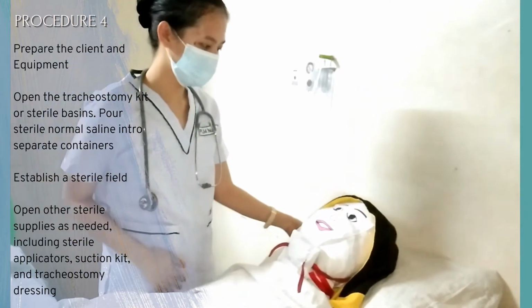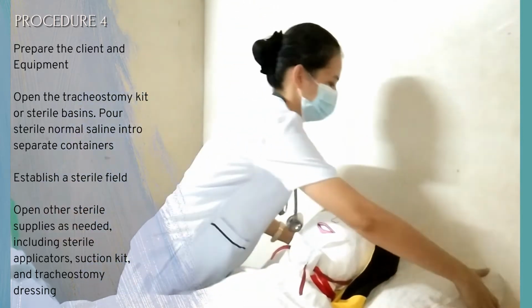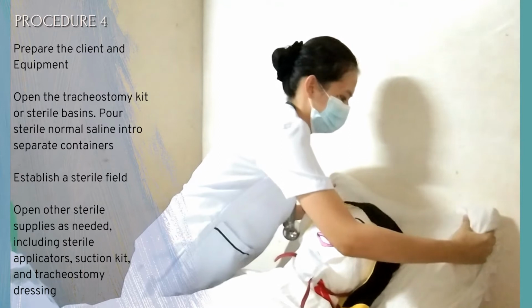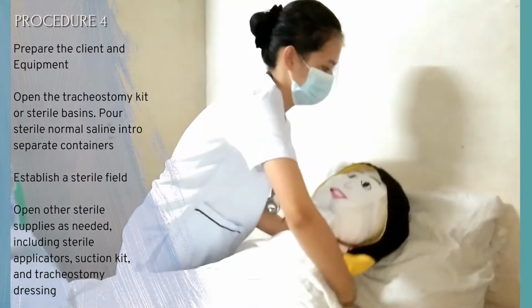Prepare the client and the equipment. Assist the client to a semi-Fowler's or Fowler's position. This is to help prevent aspiration of secretions as gravity facilitates drainage of secretions.